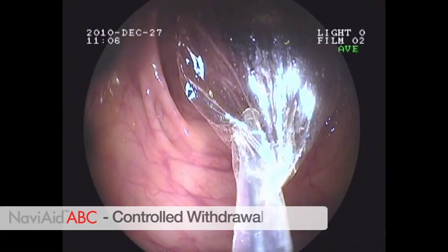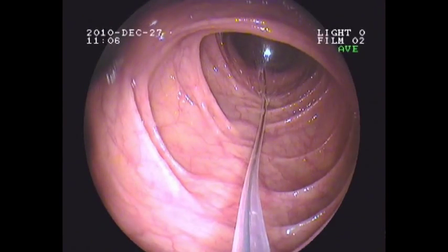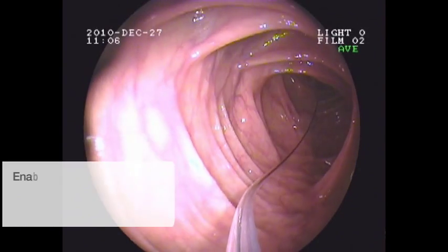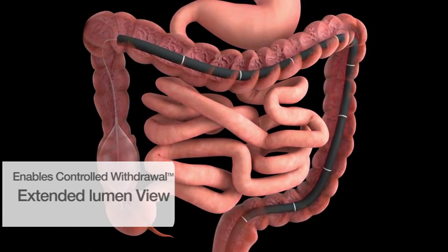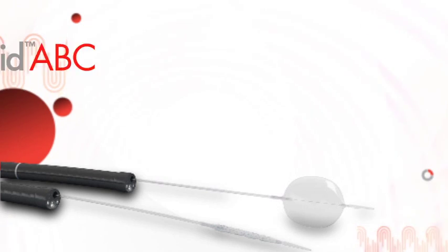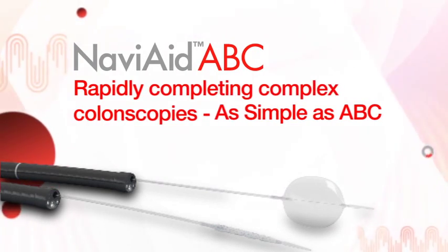Performing controlled withdrawal of the colonoscope with the Naviaid A-B-C while inspecting the colon prevents bowel slippage and provides extended lumen view. The Naviaid A-B-C provides increased detection yield. Rapidly completing challenging colonoscopies is as simple as A-B-C.